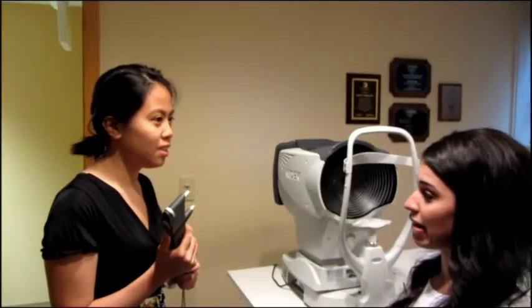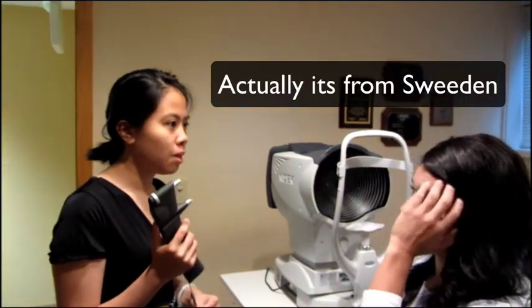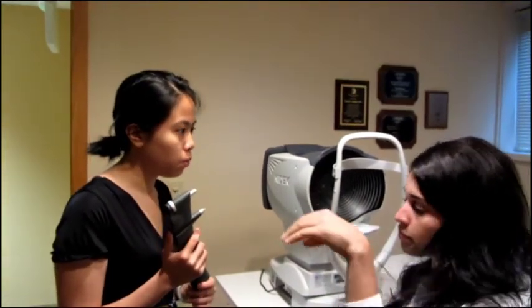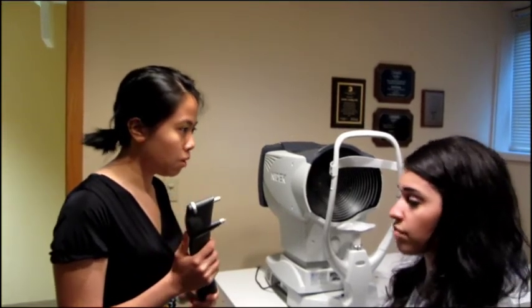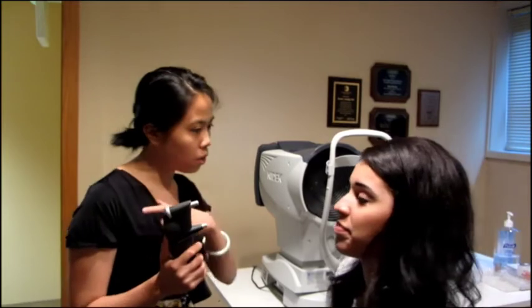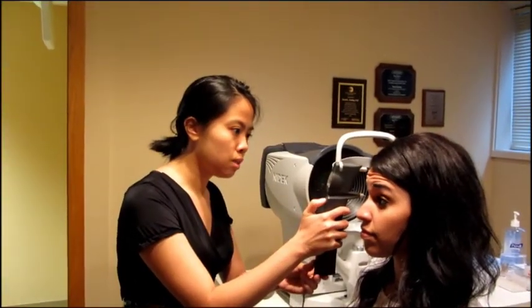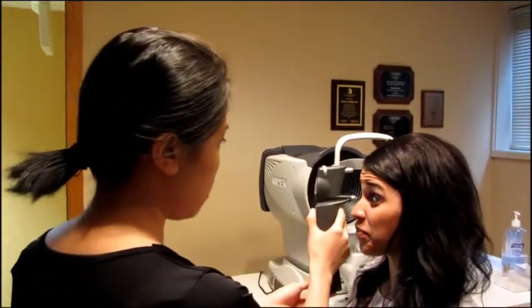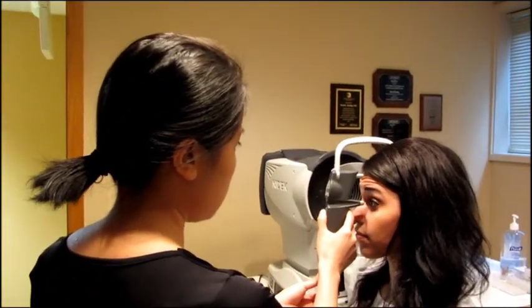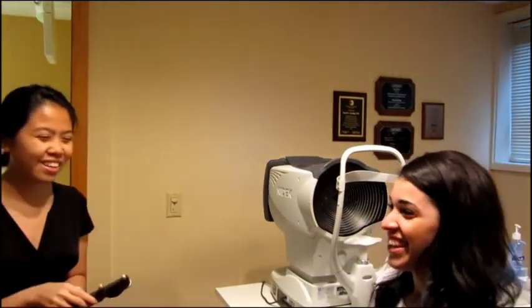So this machine is used to measure the pressure of your eye. It's a machine from Finland, and that makes it so that we can get the pressure without a puff of air. I'm going to get really close, but don't worry — there won't be a puff of air, it'll just be a soft touch. Go ahead and look over my shoulder. [Performs measurement on first eye.] Good job. Now I'm going to do your other eye — look over my shoulder. [Performs measurement on second eye.] Great job, all done. Thank you.